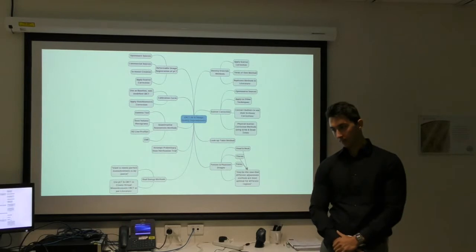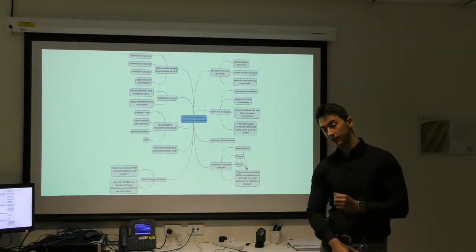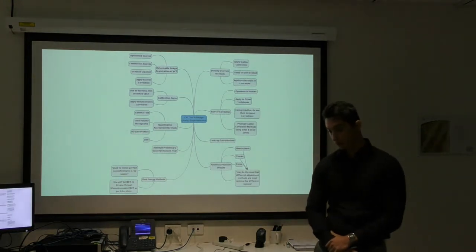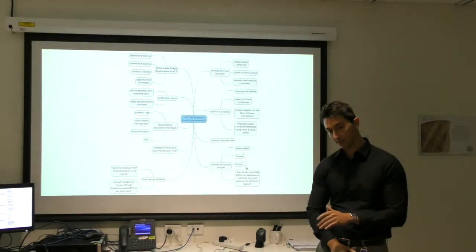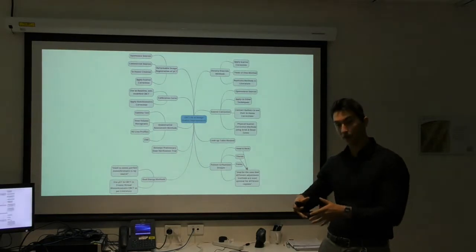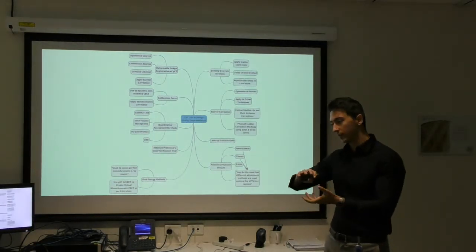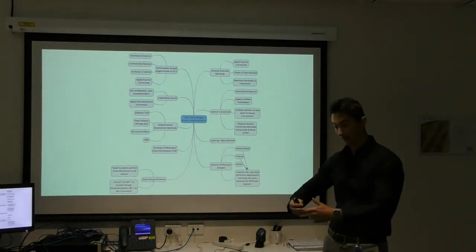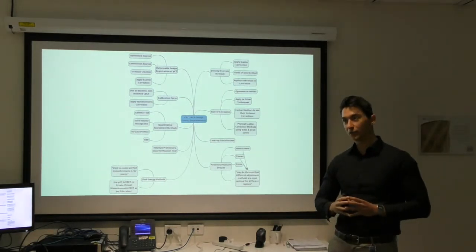So the physics behind the acquisition itself is exactly the same. It's what happens after that is different. In fact, there was a study that came out that used a quarter of the data points compared to a standard CBCT acquisition, except they used iterative reconstruction. Because of the nature of iterative reconstruction, it modifies the image a little bit, and then it iterates and compares to the error matrix and modifies it a little bit again. Even with a quarter of the data points, it still produced an image.